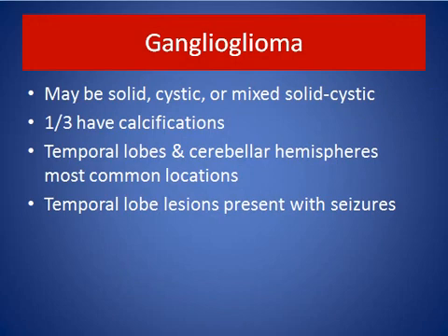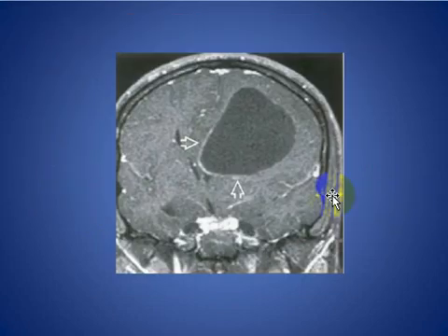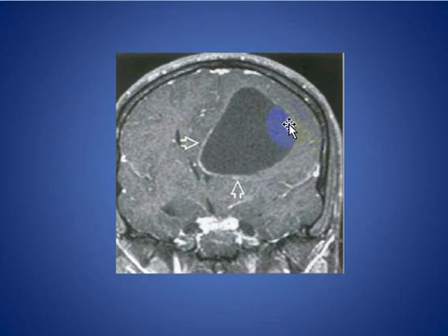Ganglioglioma: may be solid, cystic, or mixed. About one-third have calcification. Temporal lobes and cerebellar hemispheres are the most common locations, and lesions often present with seizures. Here we see a coronal T1 fat-sat MRI with a ring-enhancing cystic lesion.